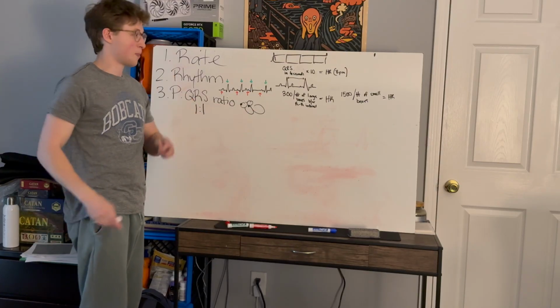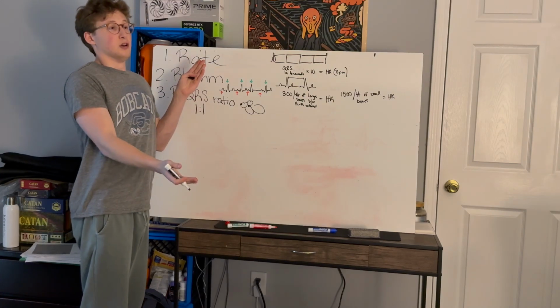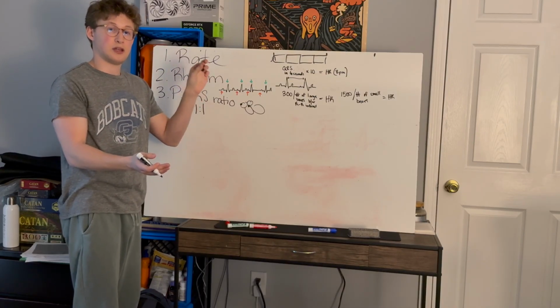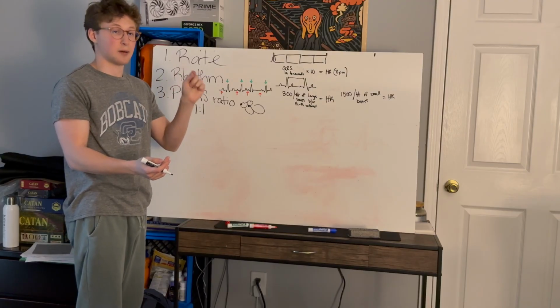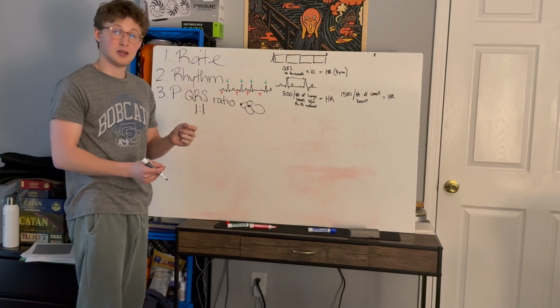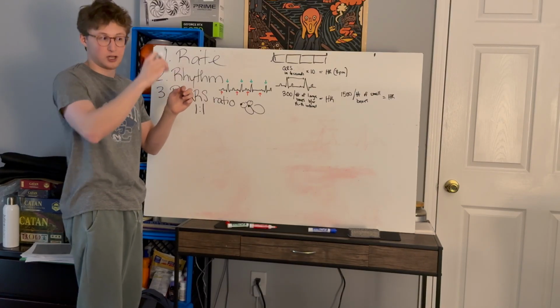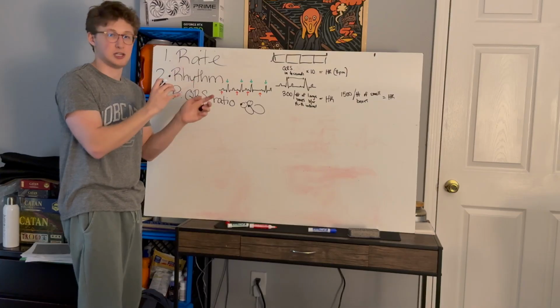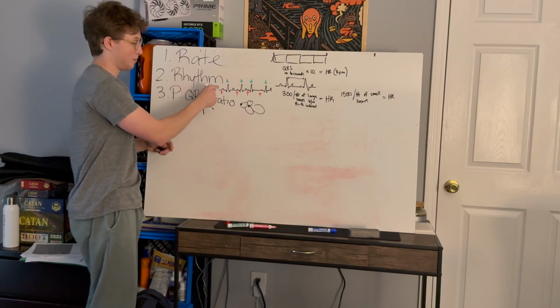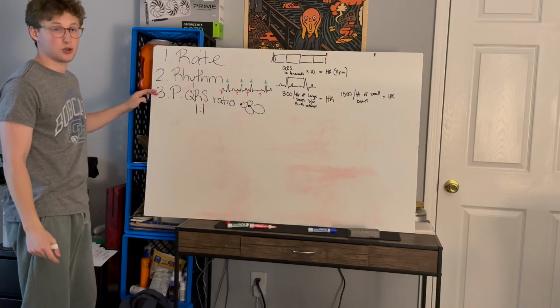Very important, okay? If there's no P wave, but there's a QRS complex, the signal that's initiating our QRS complex probably is not originating in the atria. Or sometimes there's a P wave and we can't see it because the rate is so fast that there's not enough time for the machine to draw out that P wave. It gets buried in the T wave or the QRS complex, okay? So it's very important that we visualize, is there a P wave for every QRS complex? Rate, rhythm, P to QRS ratio.